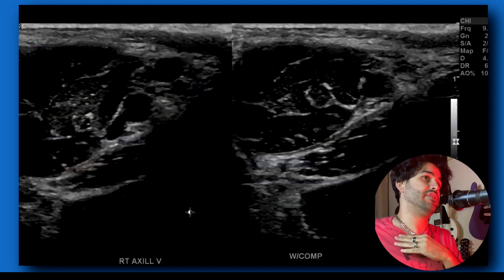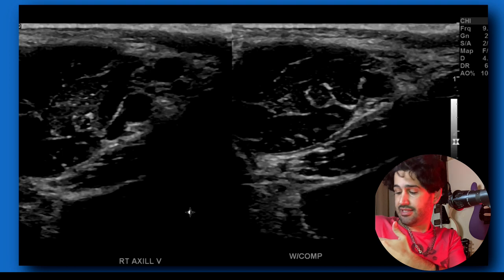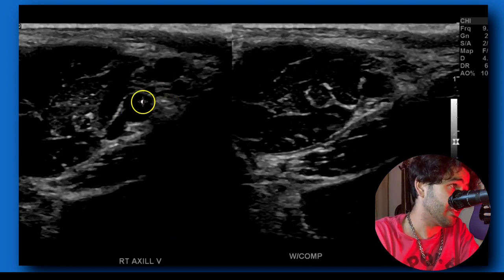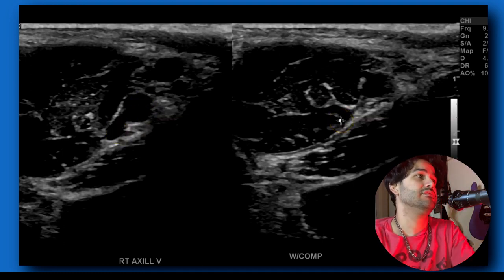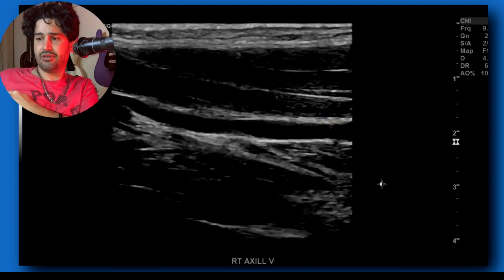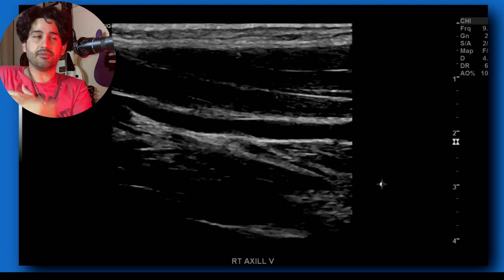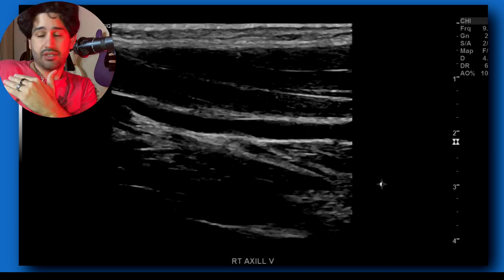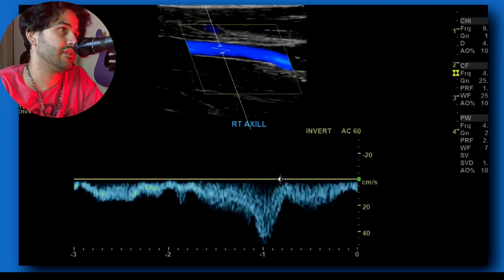Done with subclavian — you can do proximal and distal if you want. Once you're done, go to the axillary vein in the armpit, where you'll have the axillary artery and axillary vein. Dual screen with compression, then longitudinal. You might have to have the patient put their arm out or rotate it away from the body to access the armpit. Sagittal axillary vein — grayscale, color, and spectral doppler.